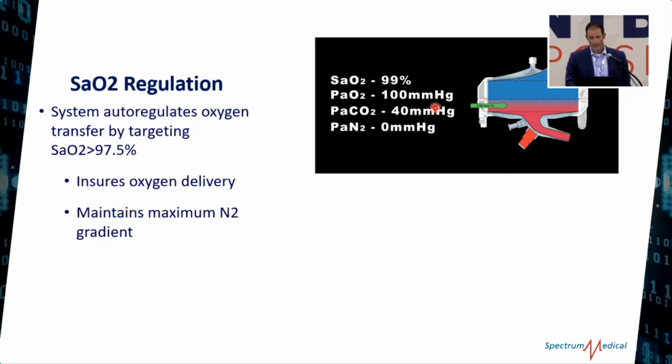There's no nitrogen given in there. So here you can see you'll have 3 liters of sweep blown through the main chamber. That's where most of the oxygenation and ventilation takes place. A reminder to the audience, our oxygenator doesn't have polyurethane heat exchange fibers in it, so everything you're looking at is all just polypropylene gas exchange fibers in these pictures. And with that second chamber, sometimes it gets no ventilation, sometimes just a little bit, and at any time you can use it as a regular oxygenator and blow equally through both chambers and use it as you normally would in an atmospheric state.